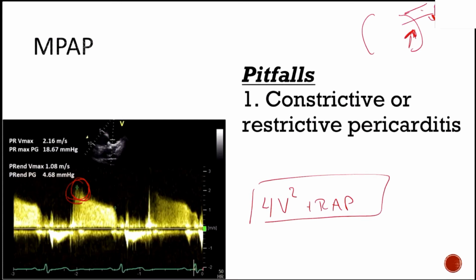It's going to be harder for me to push blood flow back here. And so this area here is going to be underestimated, right? Because I can't meet this velocity. It's going to be a more slow, tedious velocity. But eventually, that velocity will slow down, equilibrate, and this will be a little bit more reliable. So your mean PA pressure is going to be the major problem, okay?